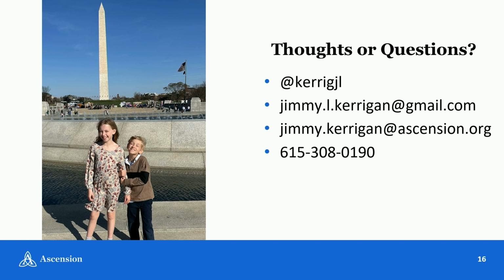Yeah, so I guess the question is, will lipoprotein A and AI plaque assessment replace calcium score? Lipoprotein A, first of all, is a blood biomarker, so I think it's very much incremental to the imaging information. In terms of whether this will replace calcium scoring, I think it depends. In patients who already undergo a coronary CTA, yes. I don't think there's a need to do a calcium score in patients undergoing a coronary CTA when you can get a plaque analysis and see how much plaque they have. In my mind, it's an unnecessary scan. Certainly a lot of institutions do a calcium score with CTA today, but in the future, why do you need that if you're going to do plaque analysis?